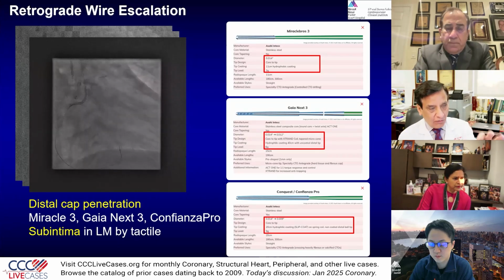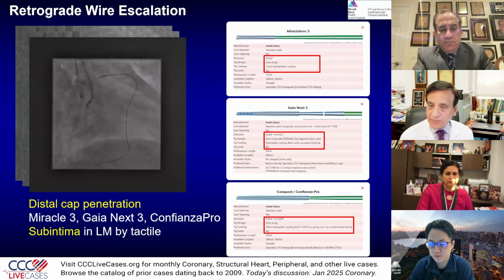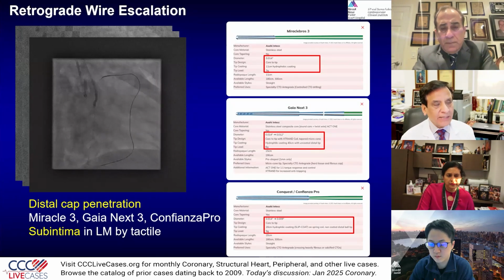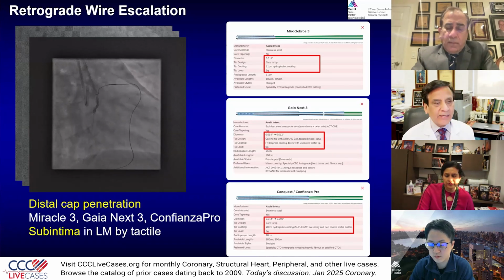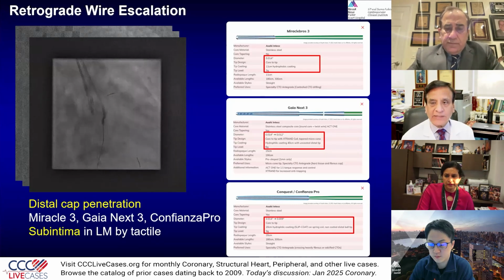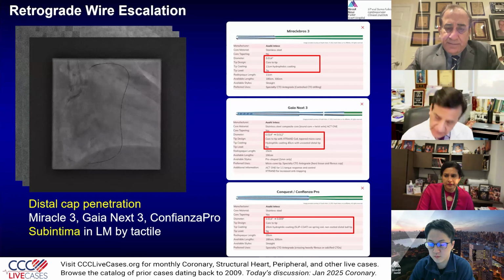Could you have seen the ostium, the occluded ostium of the LAD? I think it's maybe for very expert people. It will be very tough for us to do it at this time. But yes, in the beginning there was definitely a validity to seeing if you can see the ostium occlusion and go antegrade. But I think it would have been tough, the way later on we know where it originated. I understood that IVUS was always there in our plan, but as a backup plan, not a front strategy. That is correct.